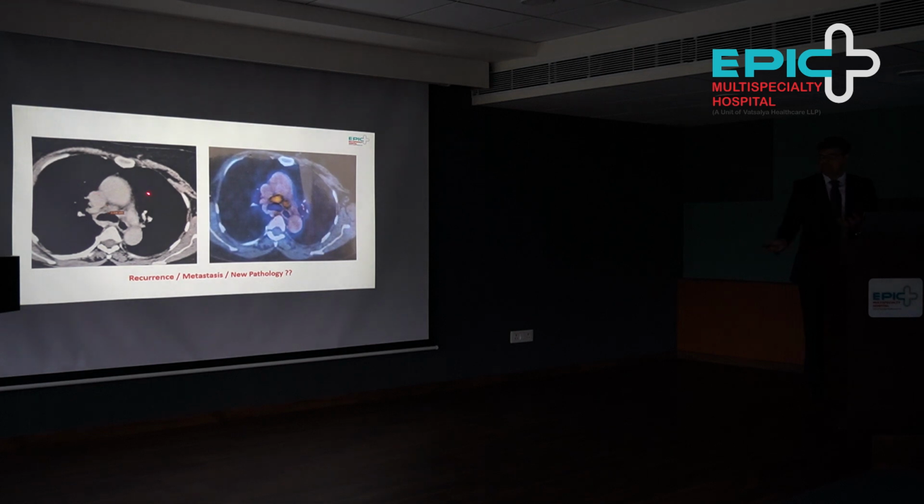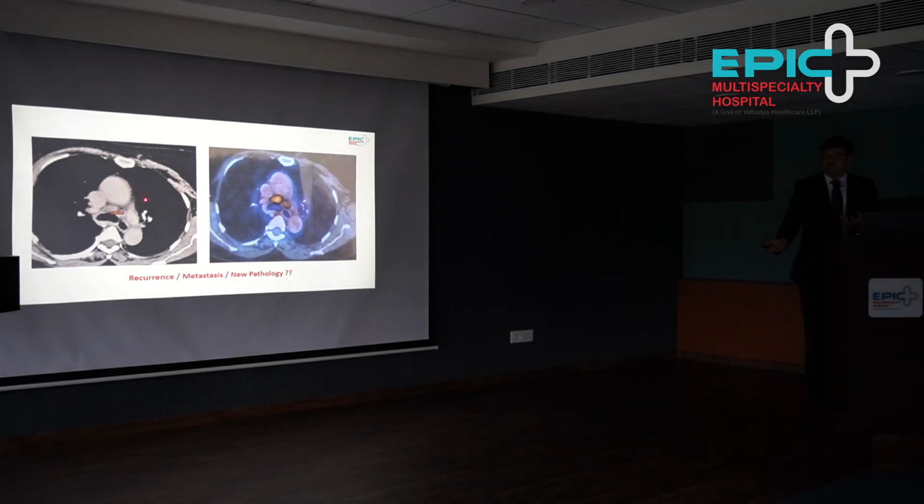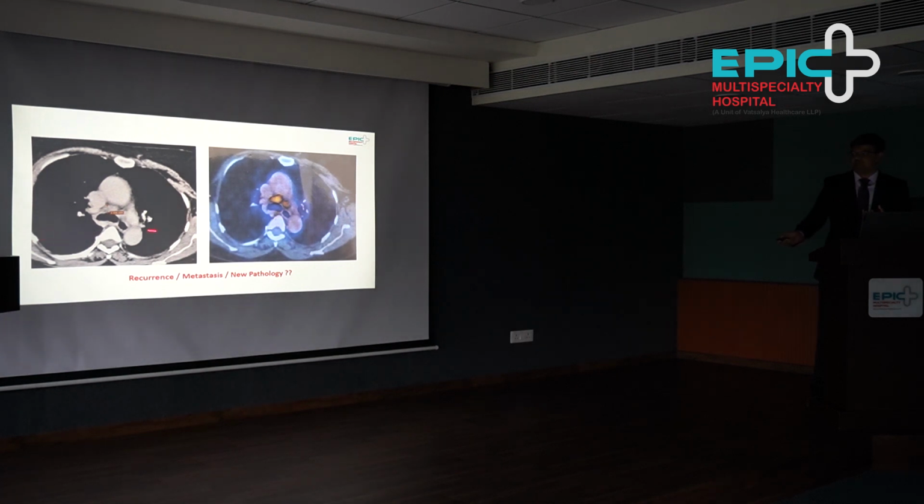So here we can see the CT scan. I'll just give a brief tour of how to interpret this slide. These black parts are lung. This is the right lung. This is the left lung.